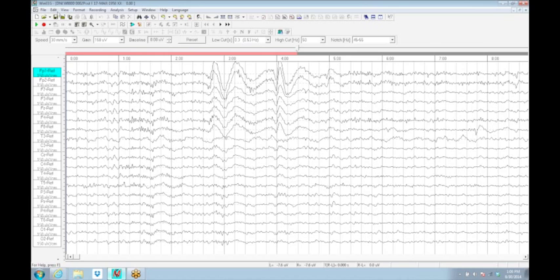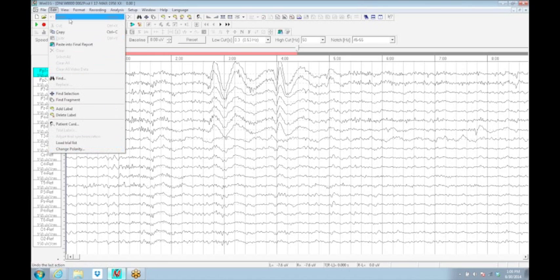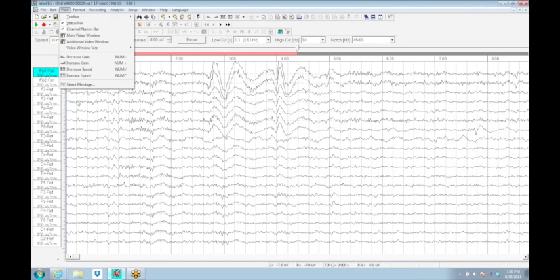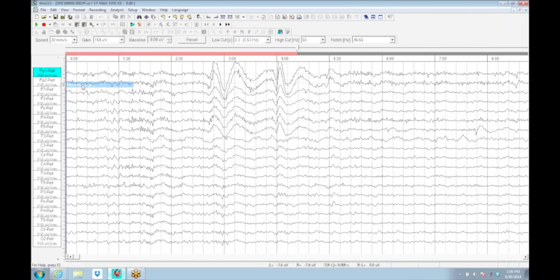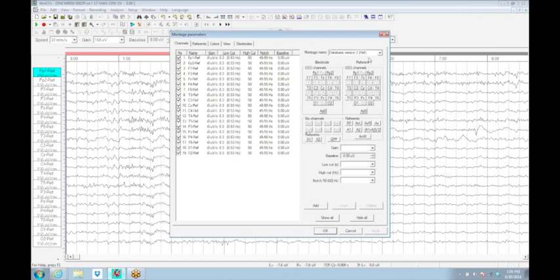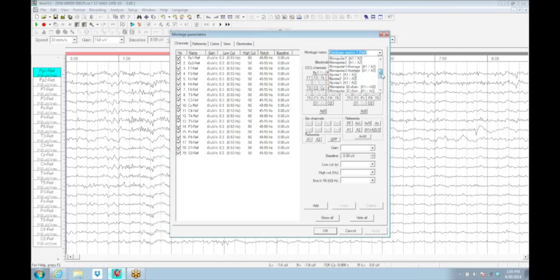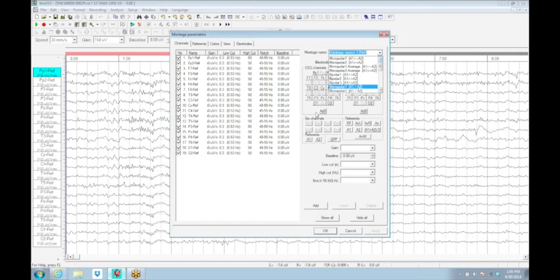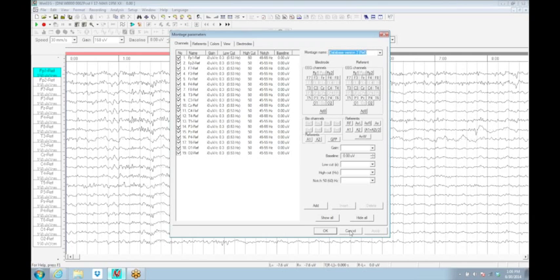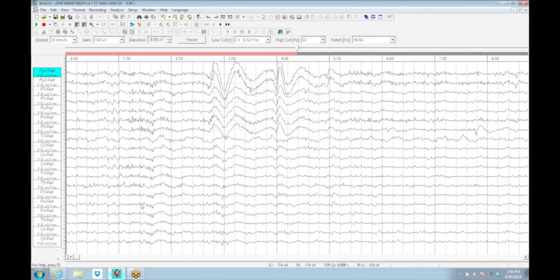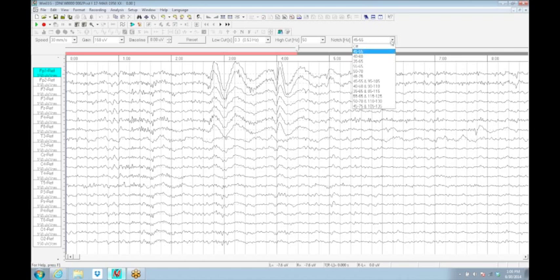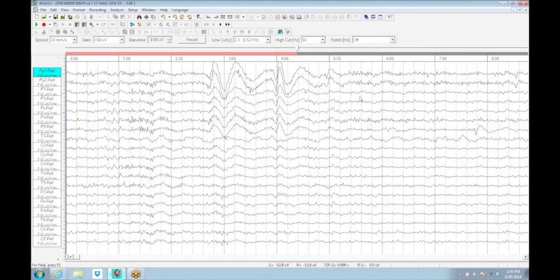There is a large list of montages that you can view the EEG in, and that list is visible here under view. You can turn on and off various channels or add channels. At this point, we have the raw EEG in. This is a European filtering convention.